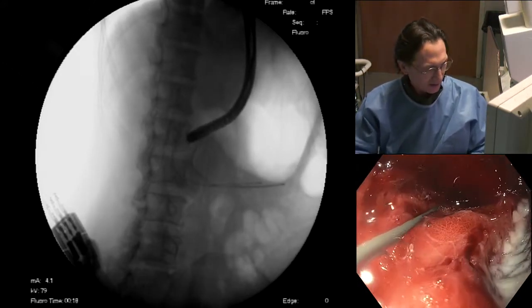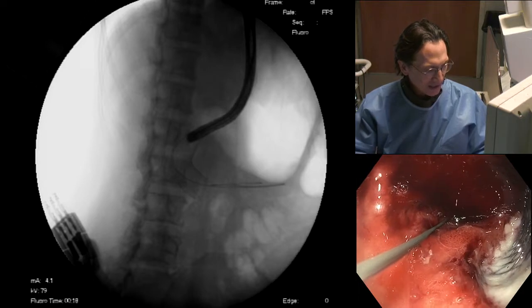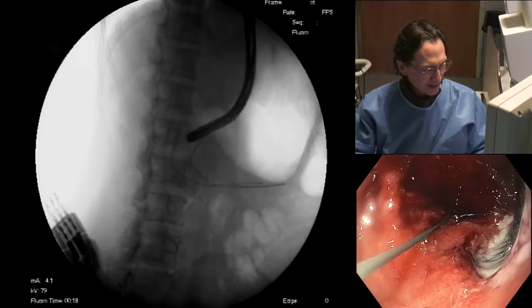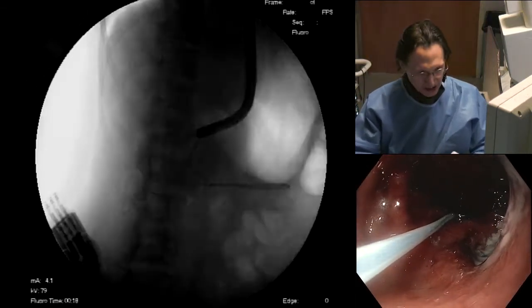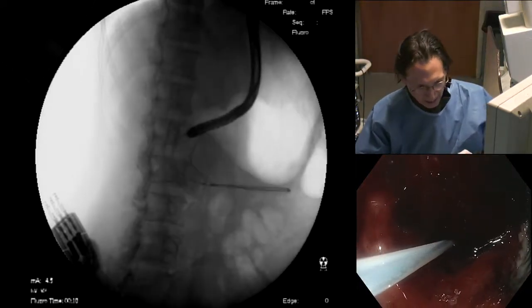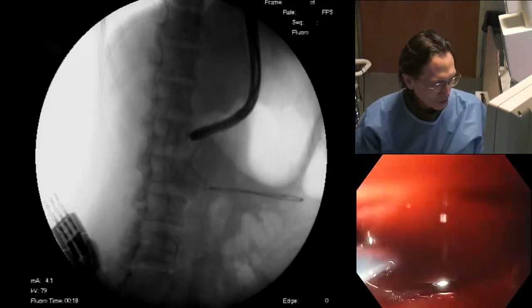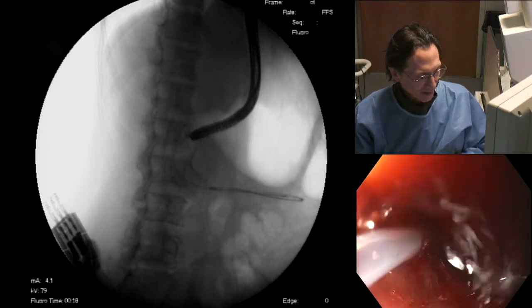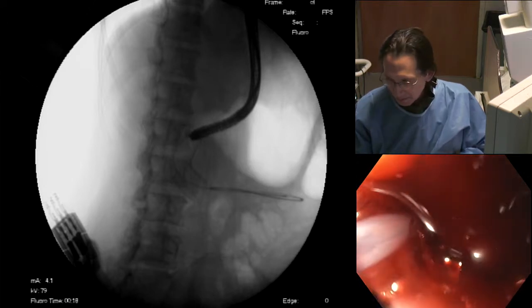Okay, I'm just going to keep pushing the catheter down. Again, on the right, you can see the exposed mesh of the uncovered stent. Keep pulling back. Here we see our catheter coming. I'm going to keep advancing this, and I'll just look on fluoro as well. You can see the catheter is going down. Looks good. Now let's pull out the wire, and we are now going to inject contrast through our catheter to confirm that we are beyond the distal end of the tumor stricture.